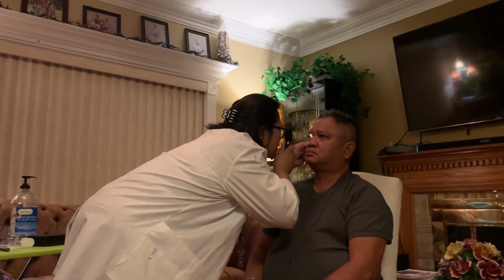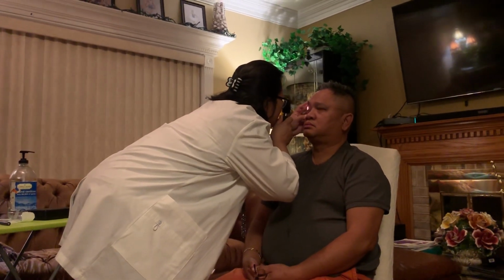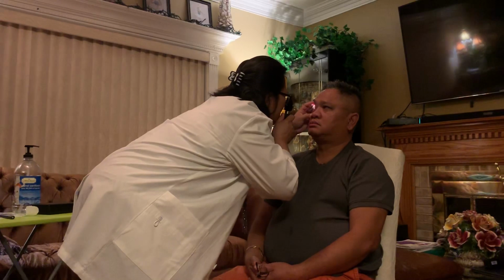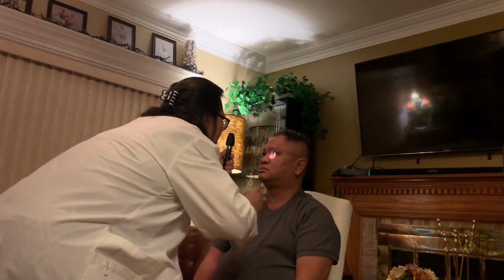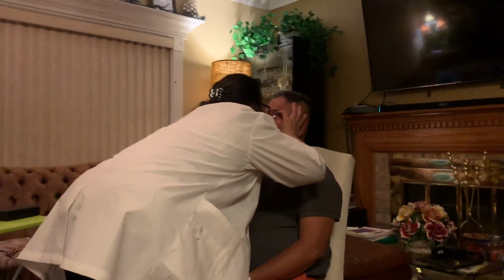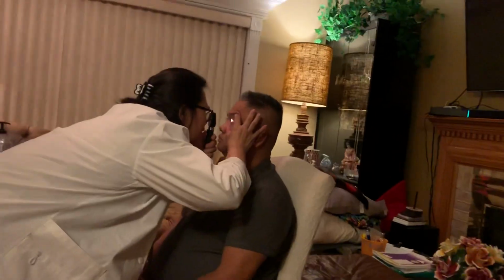All right. I could see the red reflex. All right. And I could see the blood vessels. I'm going to go towards that and check for the optic disc. Okay. All right. And I will do the same way on the other side. So I will use my left hand to check on your left eye. Okay. I could see the red reflex. Okay, and I could see the blood vessels and the optic disc.